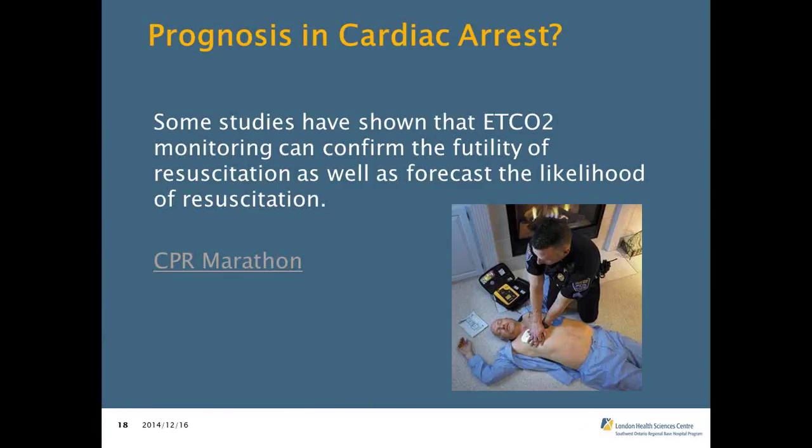And Harold. So the reason we showed that video, well, it was a great outcome, especially at this time of year. Apparently, it was reported that end-tidal carbon dioxide monitoring was utilized throughout this call when the paramedics arrived, and that he consistently maintained an end-tidal CO2 of 28 to 36, so they used it for effective chest compressions.